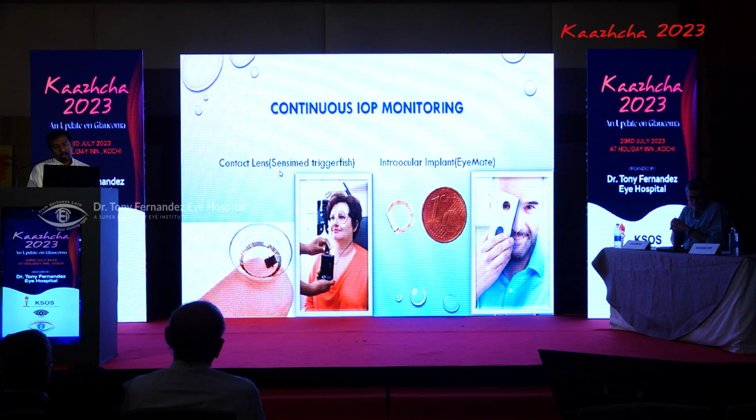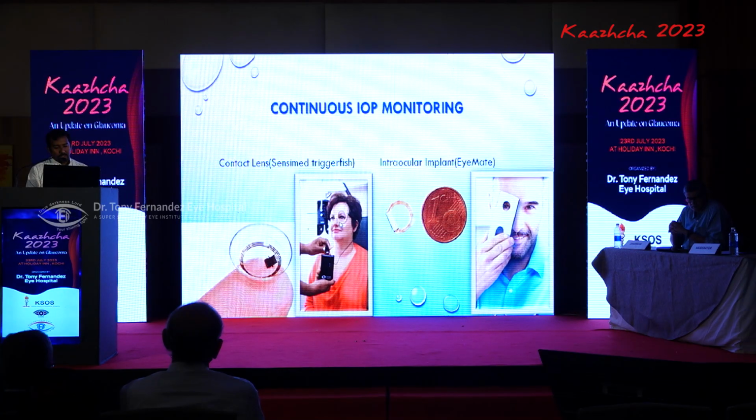There is the contact lens based tonometer, the Sensimed Triggerfish, which is a contact lens with some strain gauge sensors. Once put on the patient's eye, it can measure any changes in the shape and strain, and this correlates to the changes in the intraocular pressure. Once this is calibrated, it can measure the intraocular pressure by electrical induction, measuring the changes in the strain and monitoring 24-hour intraocular pressure, truly 24-hour intraocular pressure.